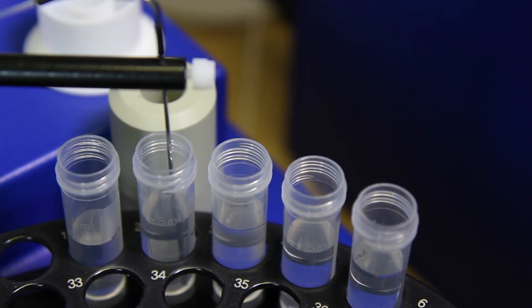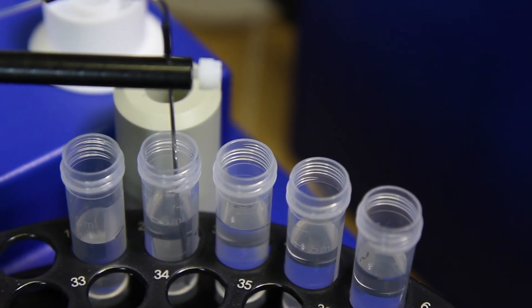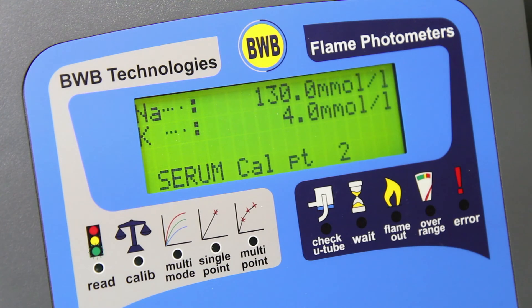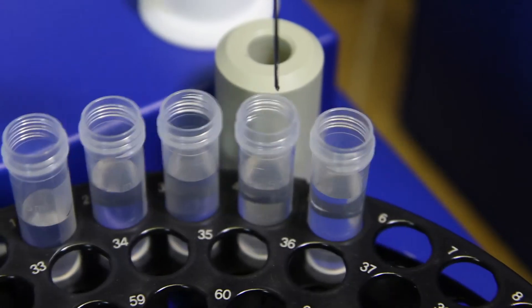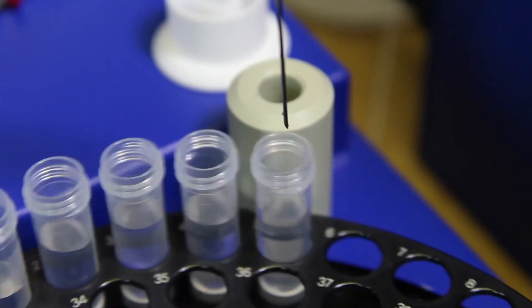The process then repeats for calibration point 2 in position 2 of the carousel. And repeats 3 more times to acquire our 3rd, 4th and 5th calibration points.